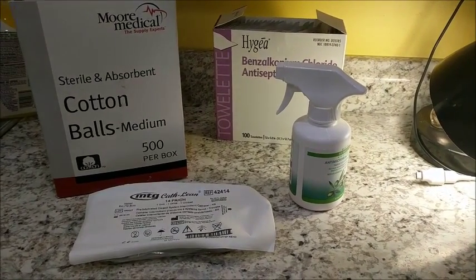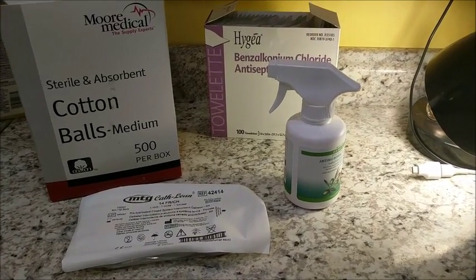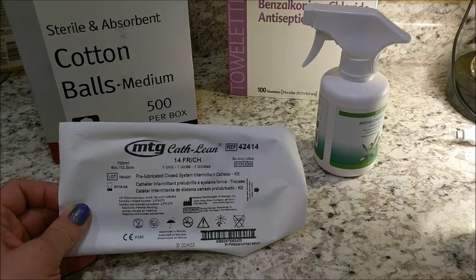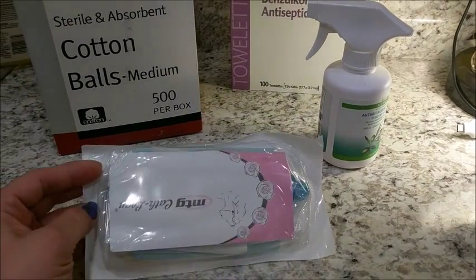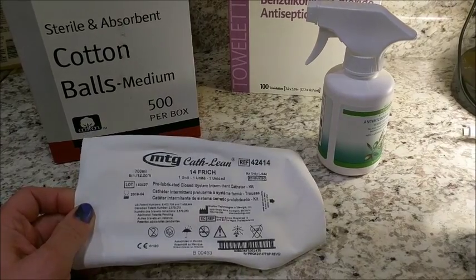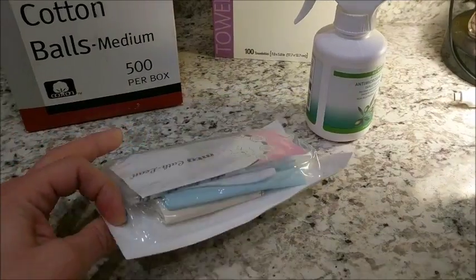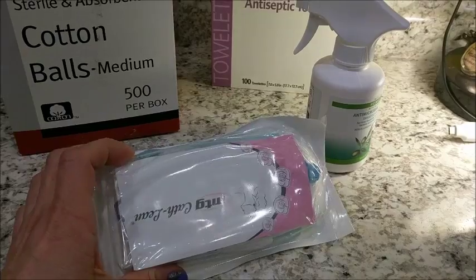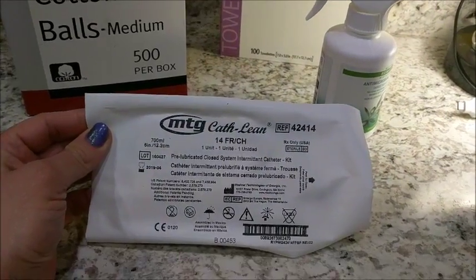Hi everyone. I just thought I would do a little instructional video on how to set up for a clean straight cath. We will be using the MTG Cathleen 14 French catheter. These are pretty cool — it's called a closed system, so I'll open it up so we can see. It comes with pretty much everything you need. We do change a couple things out and we'll go over that as we get into the video. Again, this is the Cathleen 14 French.